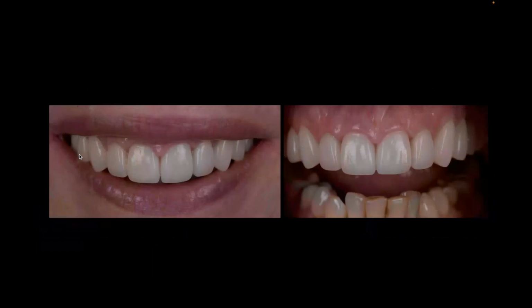But yeah, Barbara's happier, and this is on the insertion date, so the papilla will still be filling in. And now we're going to address the lower teeth in the final. So the point was, incisal edge, she's got a little effect, she's got a little transparency, a little color and warmth going through there, as compared to what I did the first time and gave her too youthful of a tooth, a little too long, a little too much brightness to it. So make sure you make those teeth really fit the person that you're working on and not the other way around. And here's Barbara's final.